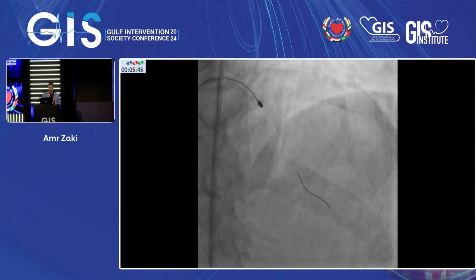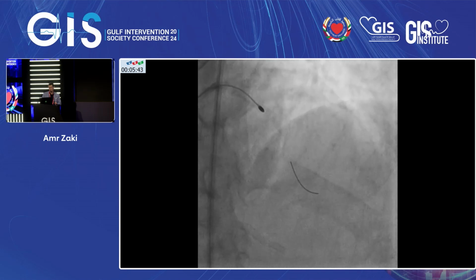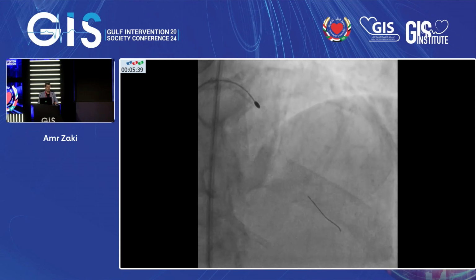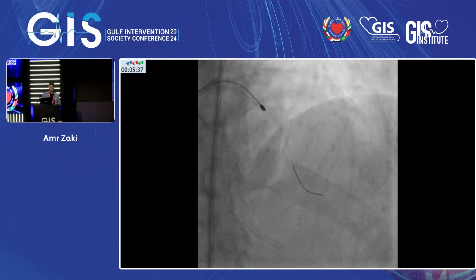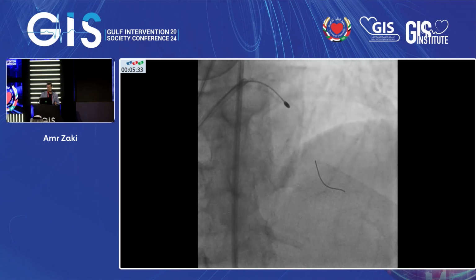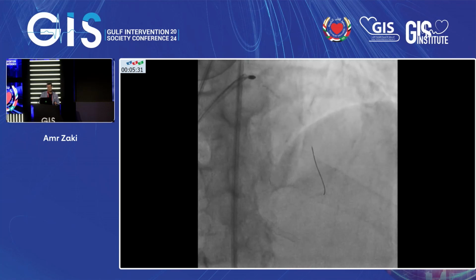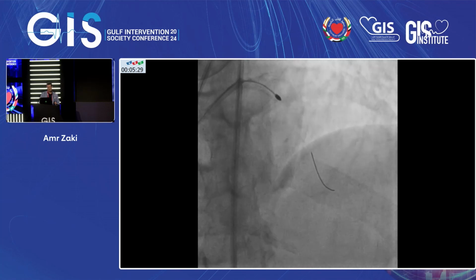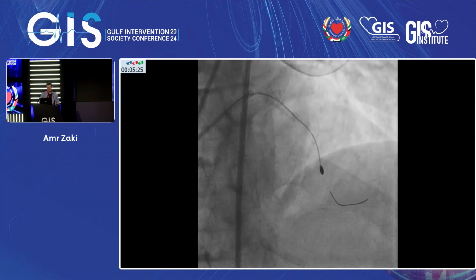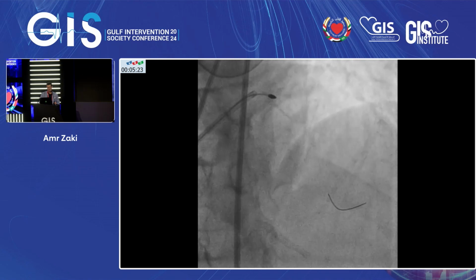After several trials, you can either use a mother and child, go for the slower speed, or go for a higher speed. So what's the next step? I was afraid to change the rota to 1.25, afraid it would get stuck. So I used the higher speed, stayed persistent, and finally it's okay.